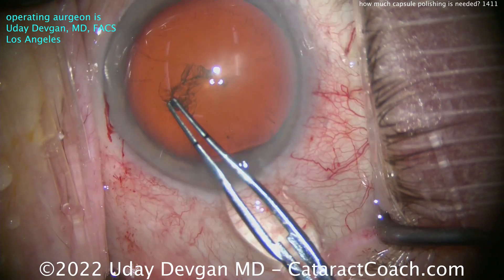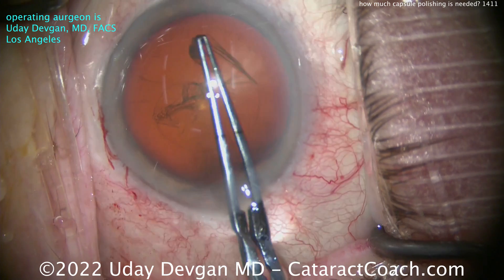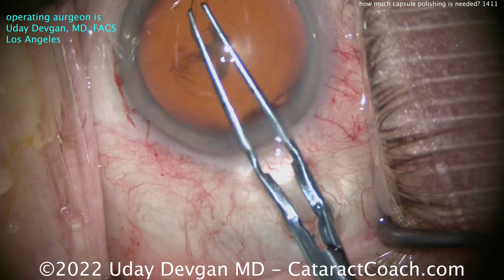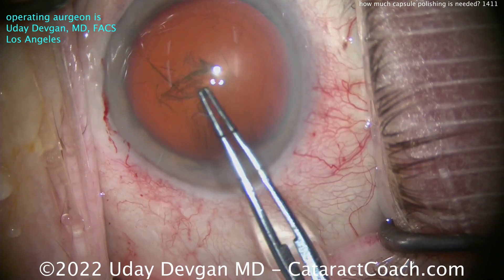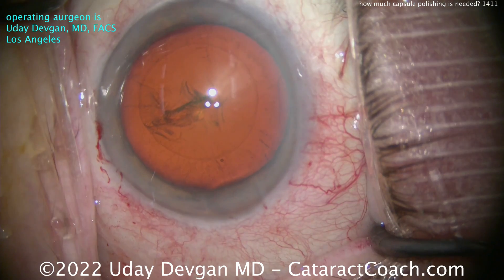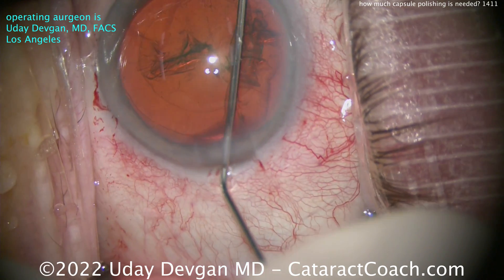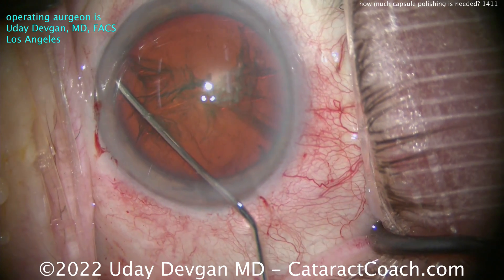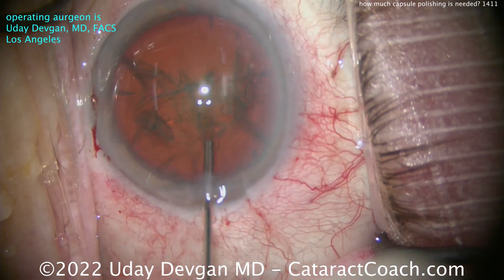That wrinkling alone should make you pause. This patient does have tissues that are a little bit weaker, and of course the pseudoexfoliation contributes to that. There's a little bit of laxity, but it's enough support that we're able to create a nice round 5mm capsulorhexis that's pretty controlled. That rhexis is beautifully centered up over the visual axis — notice how the Purkinje images are in the absolute center. Let's get some hydrodissection done.